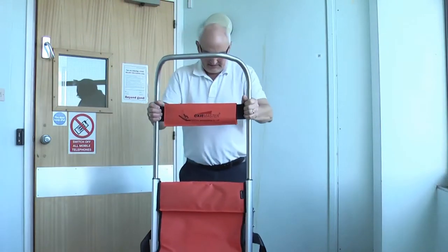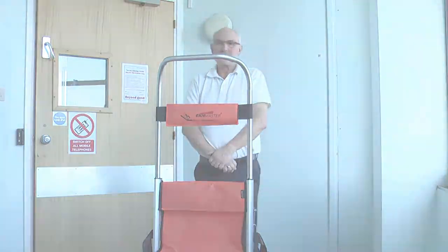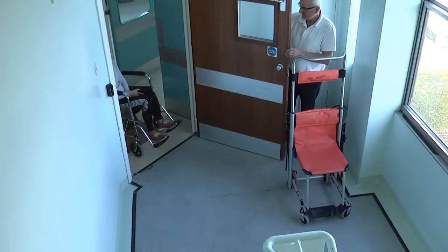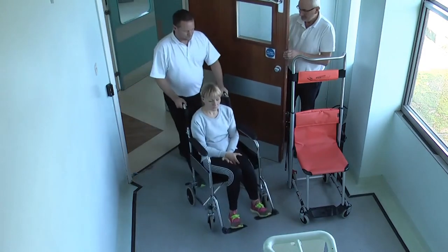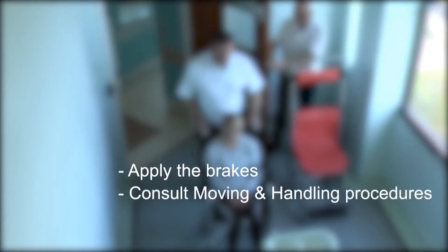Transfers from wheelchair to evacuation chair should be done as close to the escape route as possible, as long as time and space allows. Place the user in the wheelchair side by side with the Versa Evacuation Chair. Ensure the brakes are applied to both before transferring the user to the Versa Evacuation Chair. All transfers should be made in accordance with your organisation's moving and handling procedures.